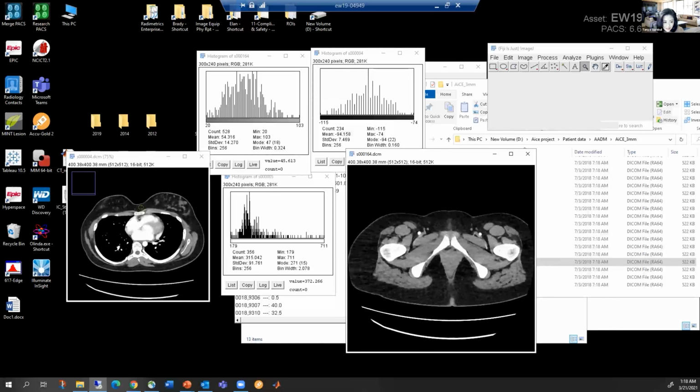All right. I lost my chat. Let's see if there's any more questions. There is one more question about the bow tie filter. Does the bow tie filter change when we do localization images? Oh, that's a good question. The answer is no, we do not change it.